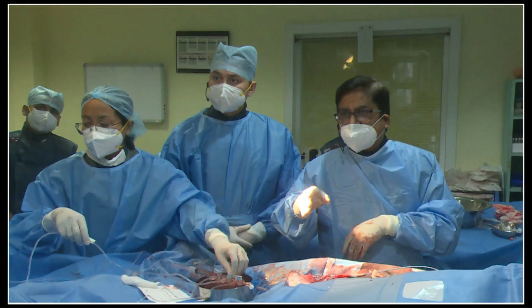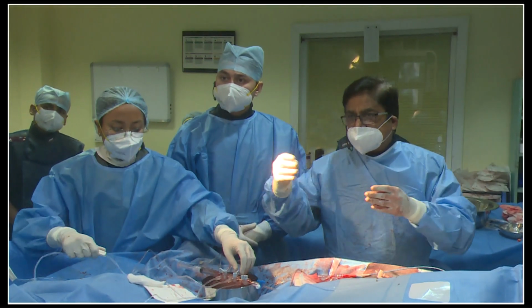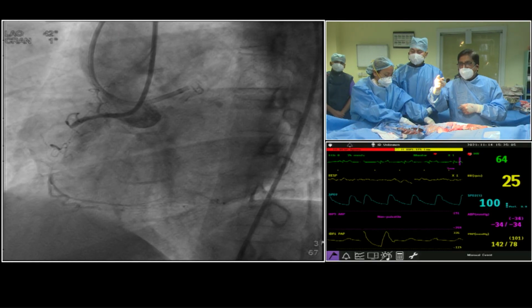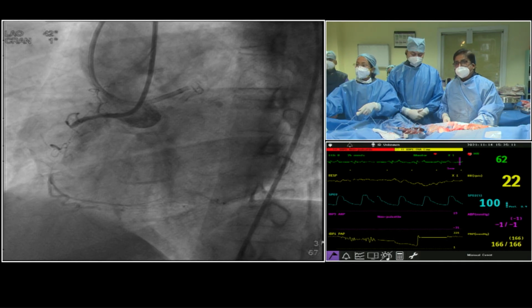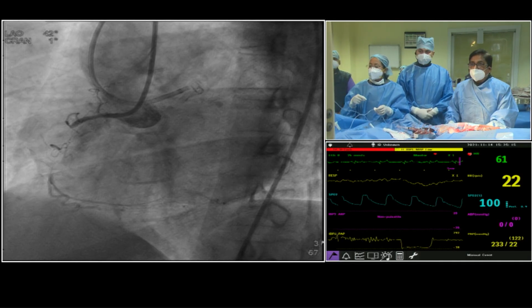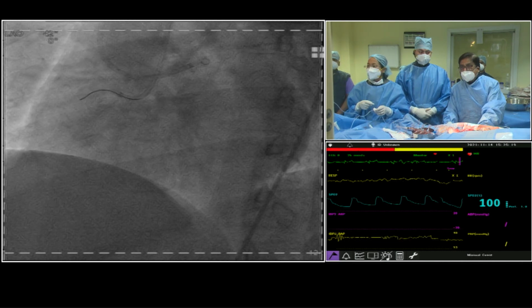We have the contralateral filling till you have the RV branch and the distal RV branch, big RV branch, and the distal RCA joining together, and the occlusion is much higher. So I wonder, this has occluded. Recently the anatomy has changed probably. So let us see how we go about it.